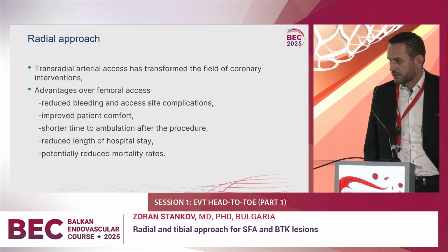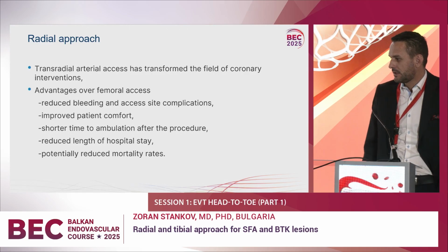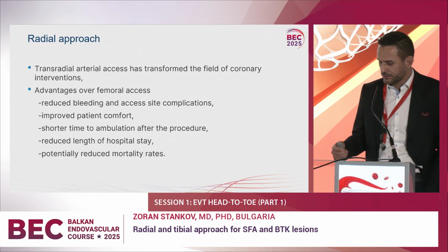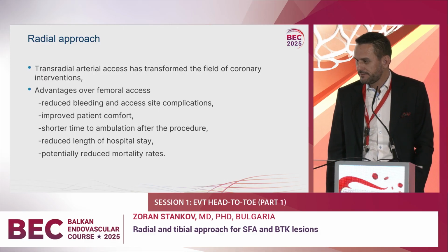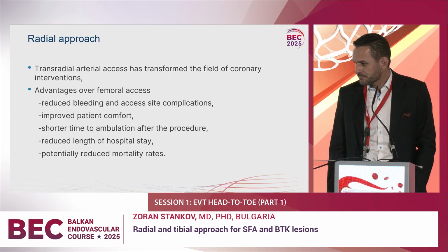The radial approach, transradial artery access, has transformed coronary intervention. In Bulgaria, it's the must-use access for coronary intervention, and we use the same radial access for carotid intervention.